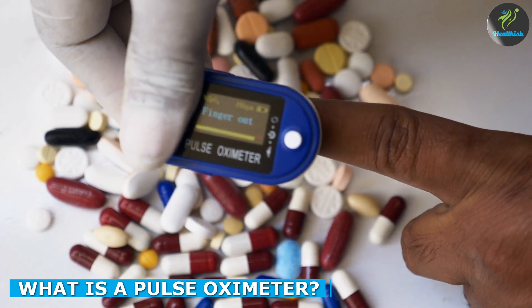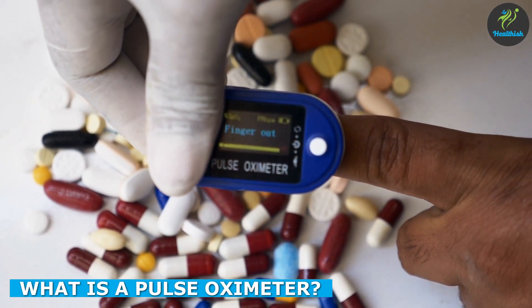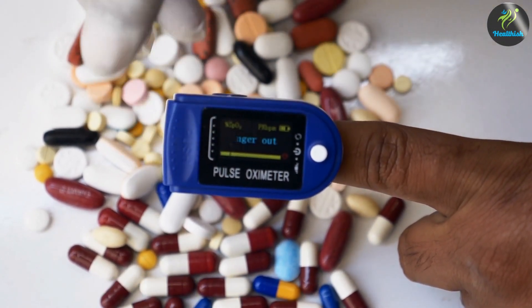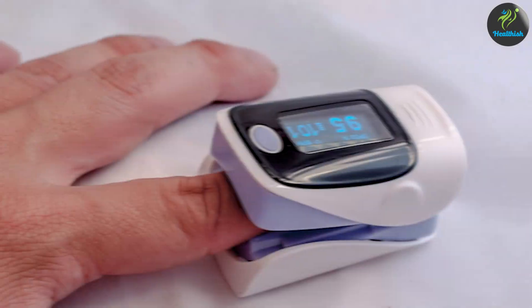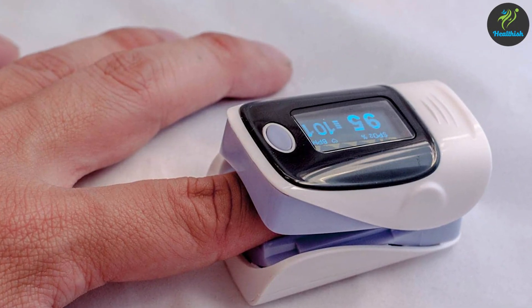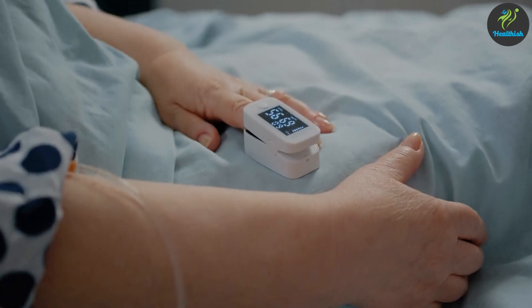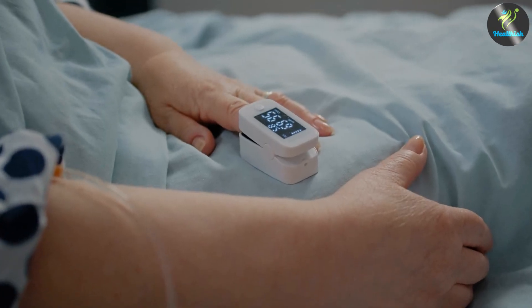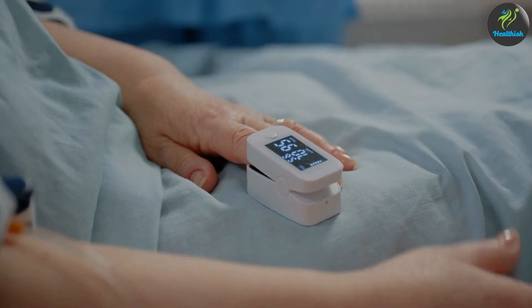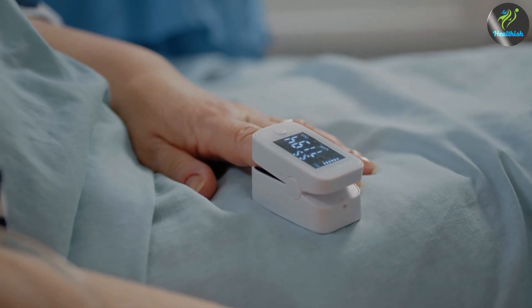A pulse oximeter is a non-invasive medical device used to measure the oxygen saturation levels in a patient's blood. It works by emitting light through the patient's skin and measuring the amount of light that is absorbed by the blood. The device then calculates the patient's oxygen saturation level by comparing the amount of absorbed light to the amount of unabsorbed light.